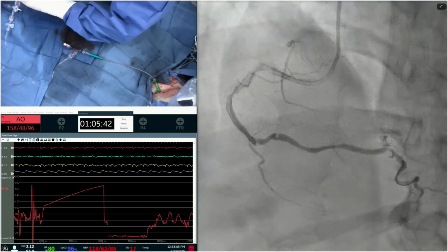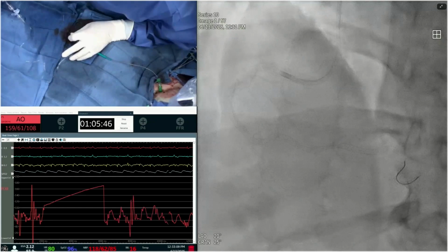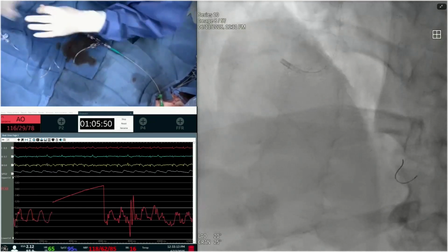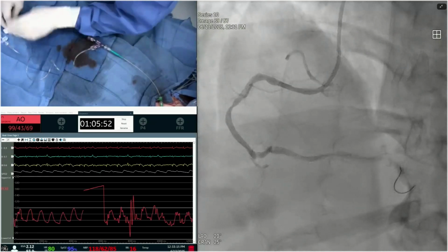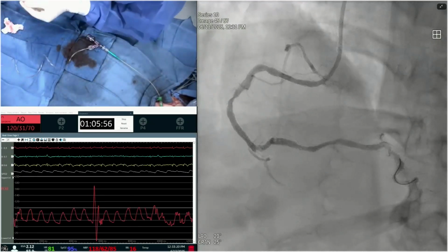And here, this is the typical of orbital. This is what we originally published when it came out with the 20 cases. It caused a deep cut. Dr. Sharma, look at what it has done, distal, right there, all into the pseudo-lesion. PDA. All that is the pseudo lesion. Yeah, that's what I want to make sure that we, because we didn't see it before.